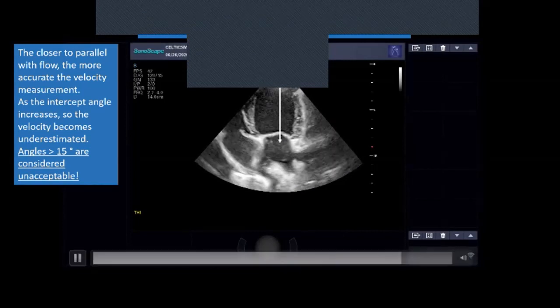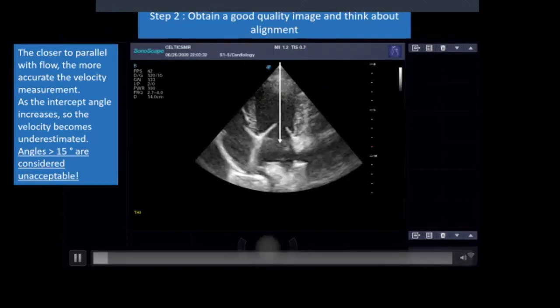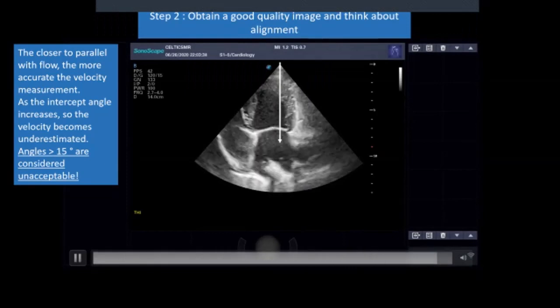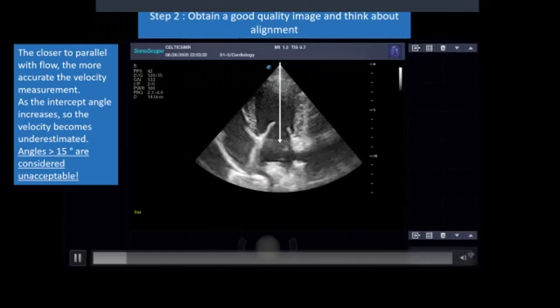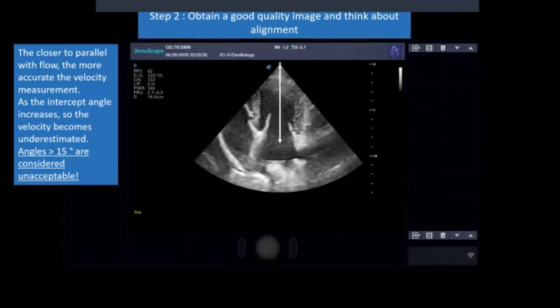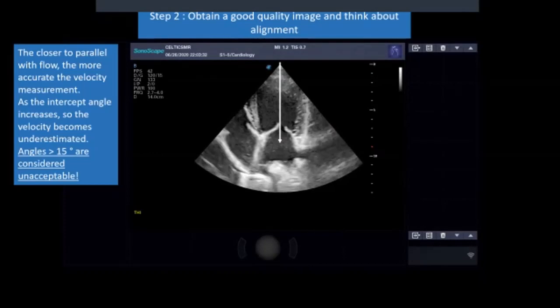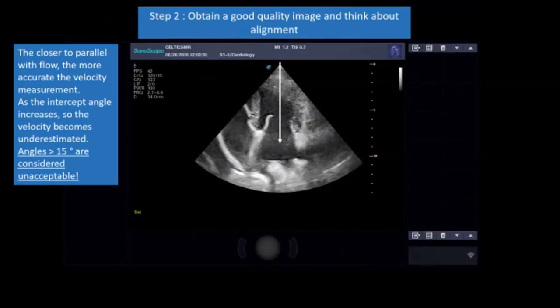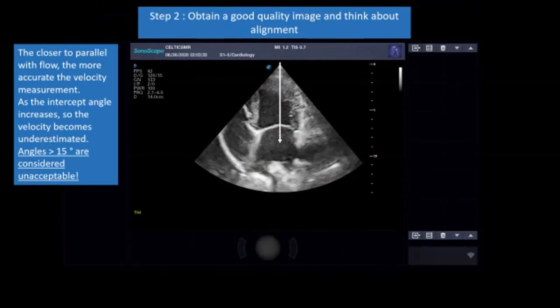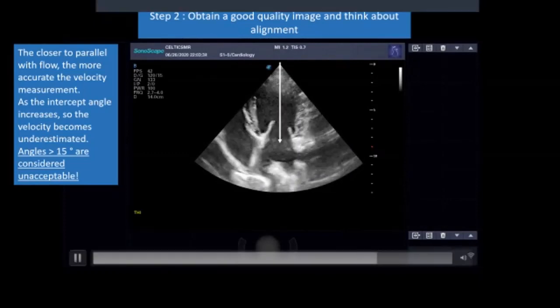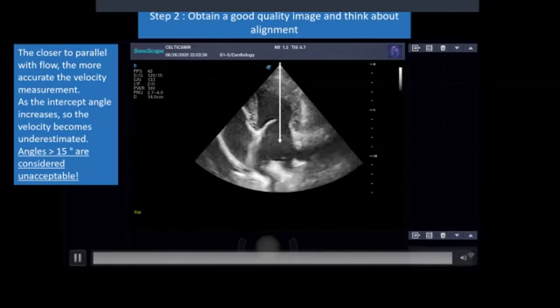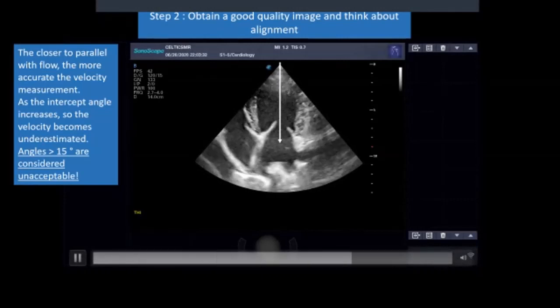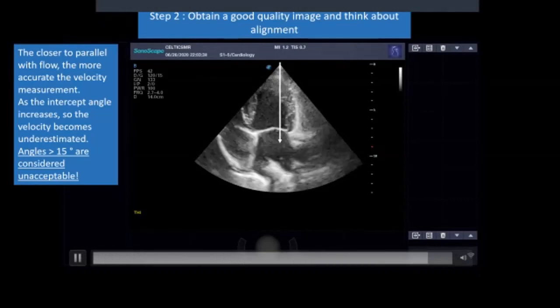Angles greater than 15 degrees are considered unacceptable. That doesn't matter quite so much for colour flow Doppler, but you get the best image with perfect alignment. Where it really counts is when you start doing pulsed wave or continuous wave Doppler and measuring velocities — you would underestimate if your angle is greater than 15 degrees, which is considered unacceptable. The other thing to think about is where your focal point is before you get started.